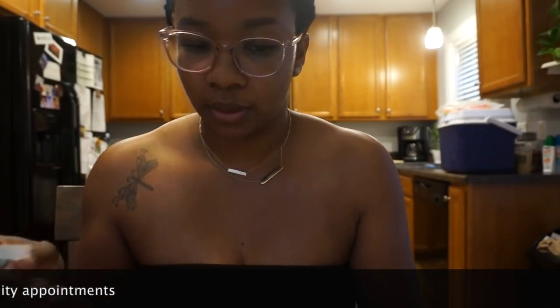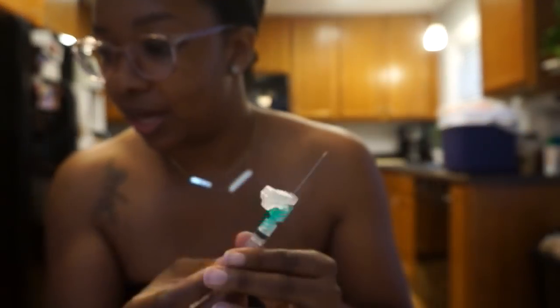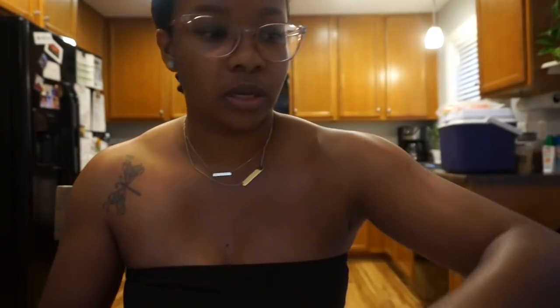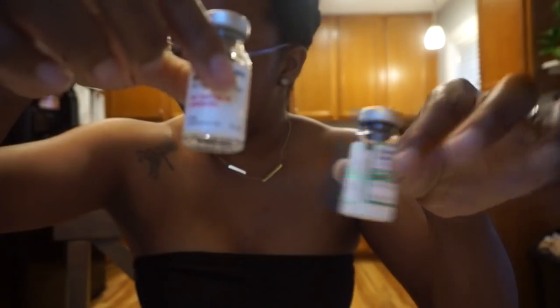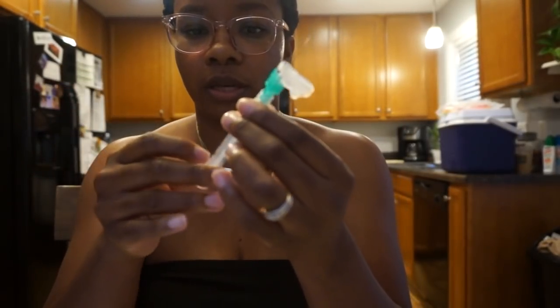Okay, here we go. Here's the needle so you can see how big this needle is. And I have to draw up 1 milliliter of the sterile water, which is here. Let me wipe off the top. We're going to alcohol wipe the top because there's two. There's a powder mix and a saline mix. And so I have my syringe ready, and I just have to draw 1 milliliter. So 2 bottles. Syringe is in.